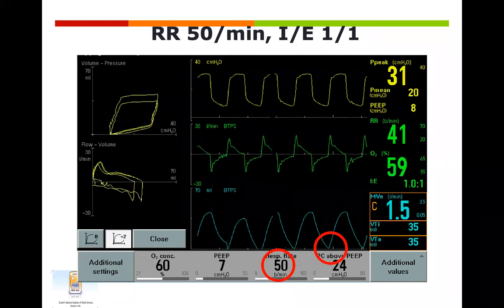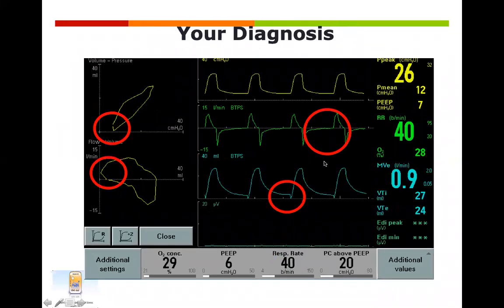And here again, there is a shorter expiratory time. What's happening here? Trapping. Some leak. Some degree of leak, like 30% leak. So there is a leak here. You can see this here is not returning to baseline before time, and here also it's not coming. But the leak numbers are not there, it's only like 3. If you see the tidal volume in and tidal volume out, there is not much difference. So there is probably a leak compensation going on.